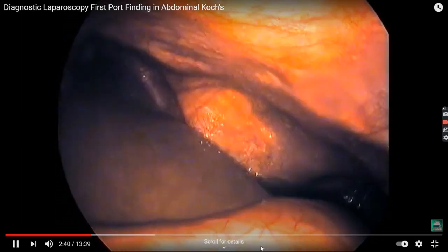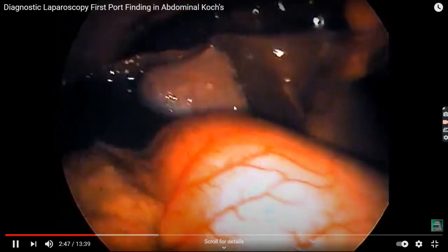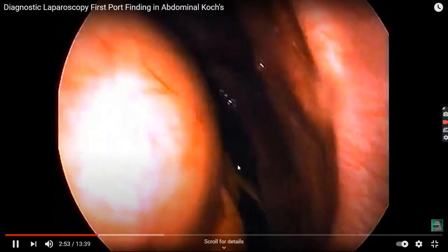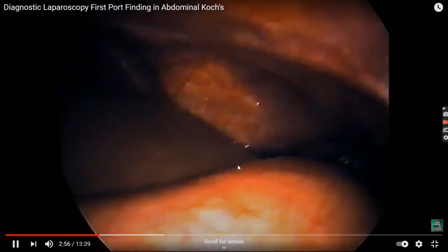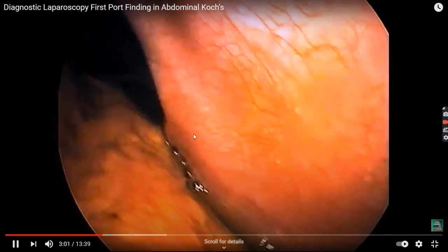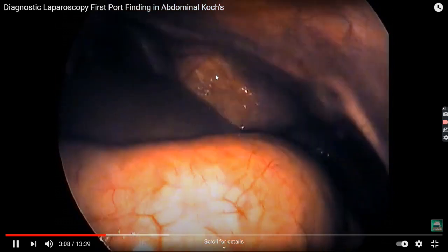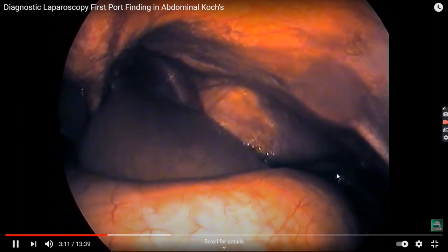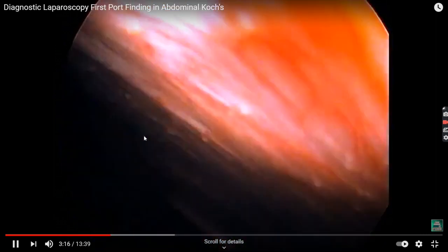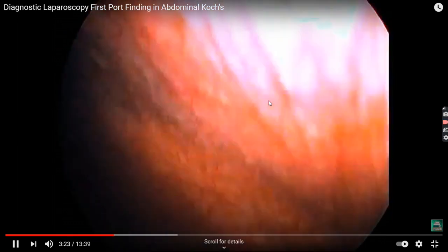This is stomach, right? This is stomach, the greater curvature, the stomach, slightly distended. This is again the ascitic fluid, the left hypochondrium area, right? And here somewhat there is spleen. Again tubercles on the left inside wall of peritoneum on the left side.